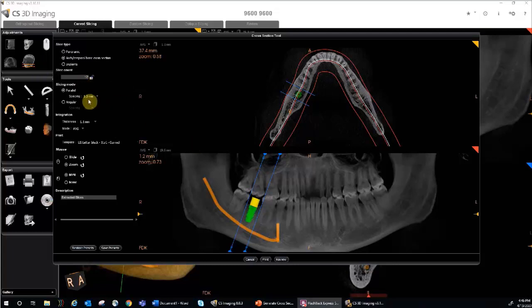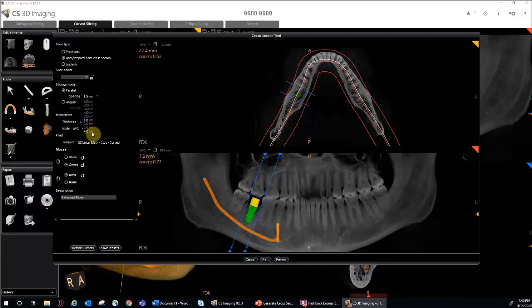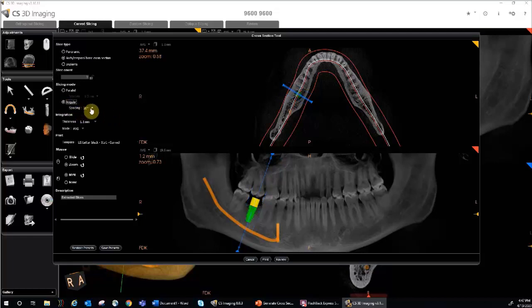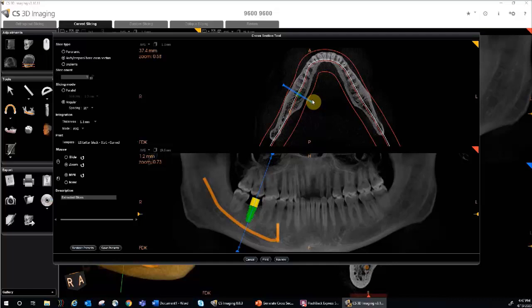If you choose parallel mode to generate parallel slices between the region of interest boundaries, then you may select your slice spacing in either micrometers or millimeters. If you choose angular, you can set the spacing in degrees. In angular mode, the cross-section report creates slices in a circle, with the center point being where the transaxial slice intersects with the axial slice.